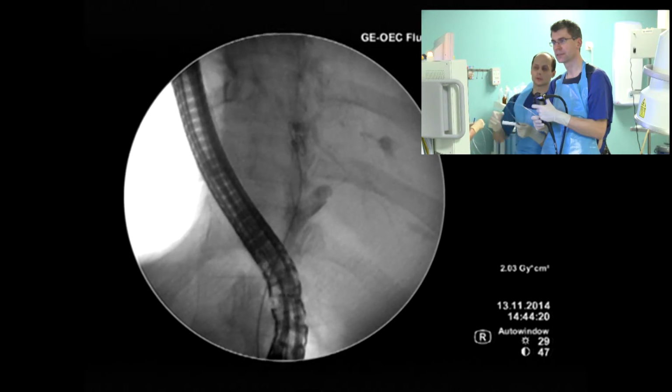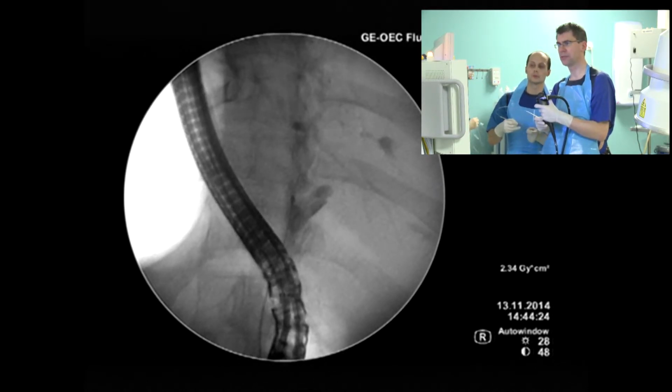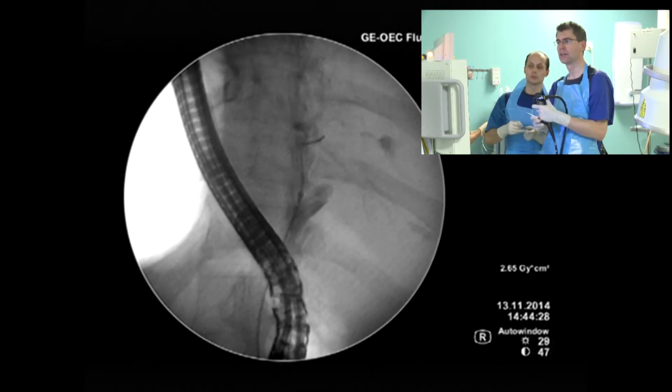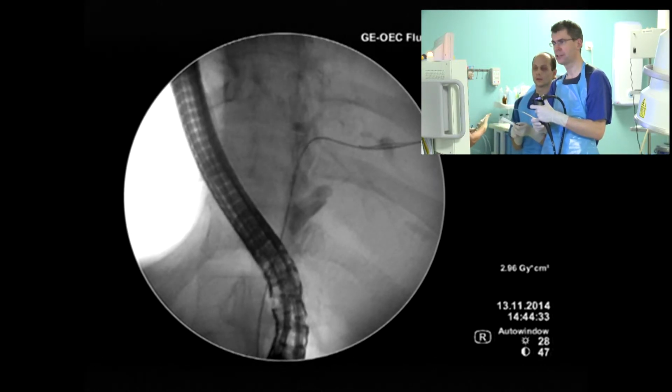What do you think about if we use the right lobe for this? No problem. Because it's longer, it could be a more stable position. That's okay. That's fine. Good. Now, exchange. Okay.